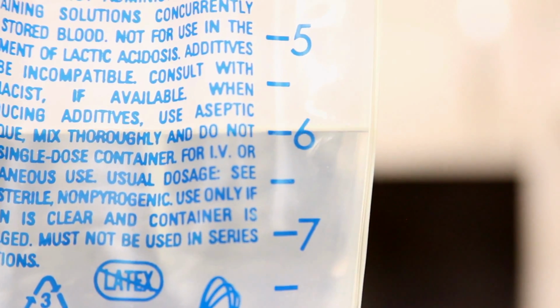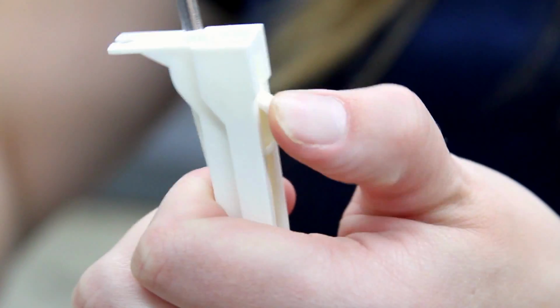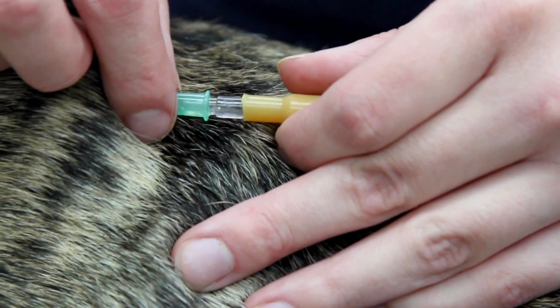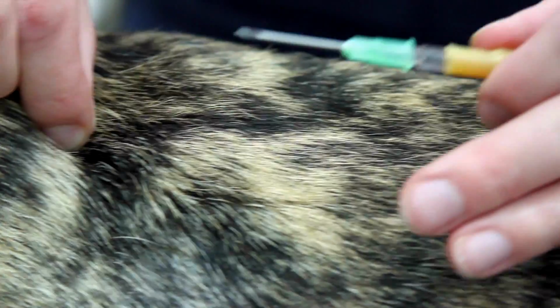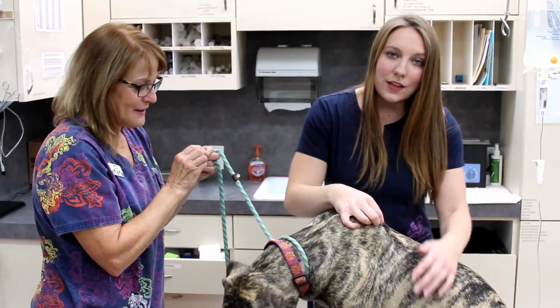So to stop the fluids, when you've gotten to the appropriate amount, you're going to roll the roll clamp back down. Just kind of pinch in that area where the needle was inserted and just slowly kind of remove the needle, put the cap back on. Always leave your line capped off.